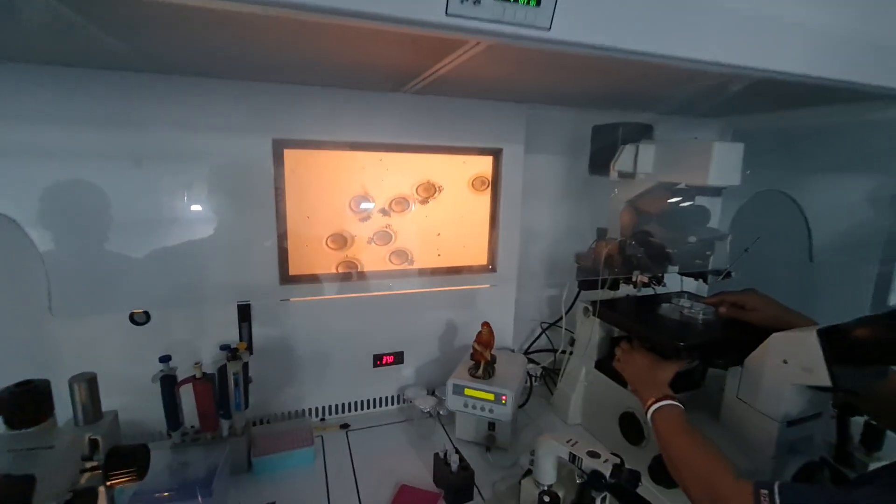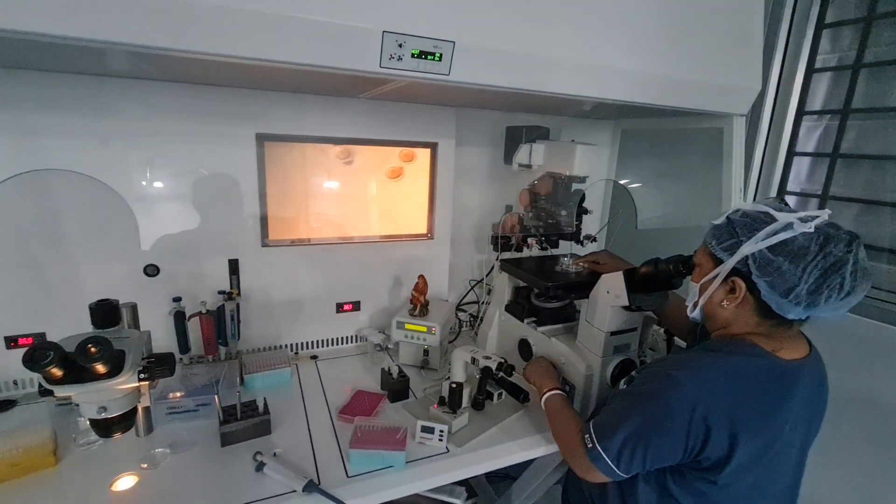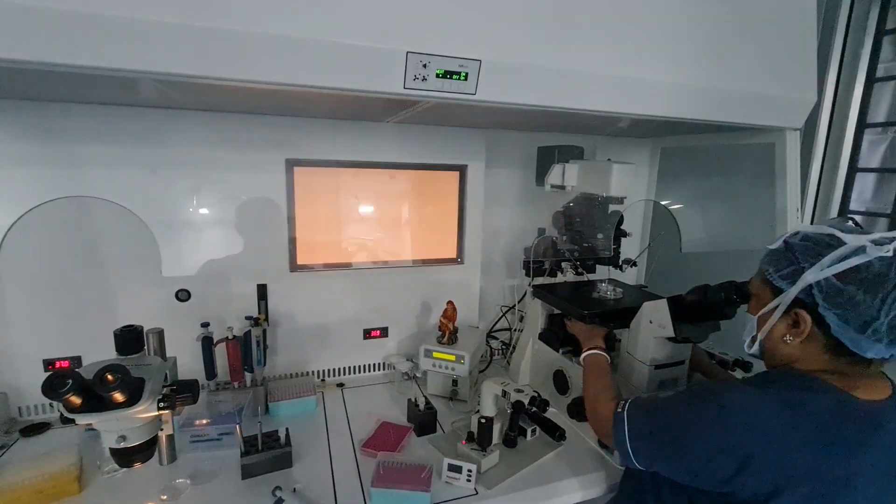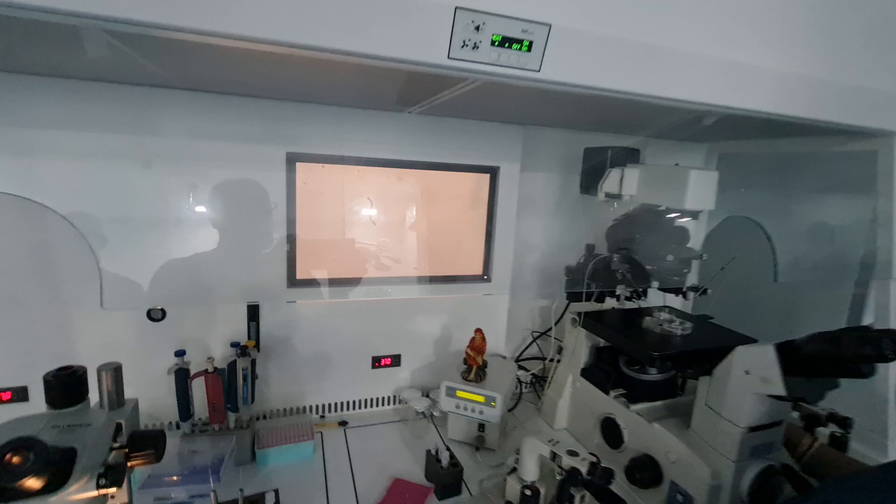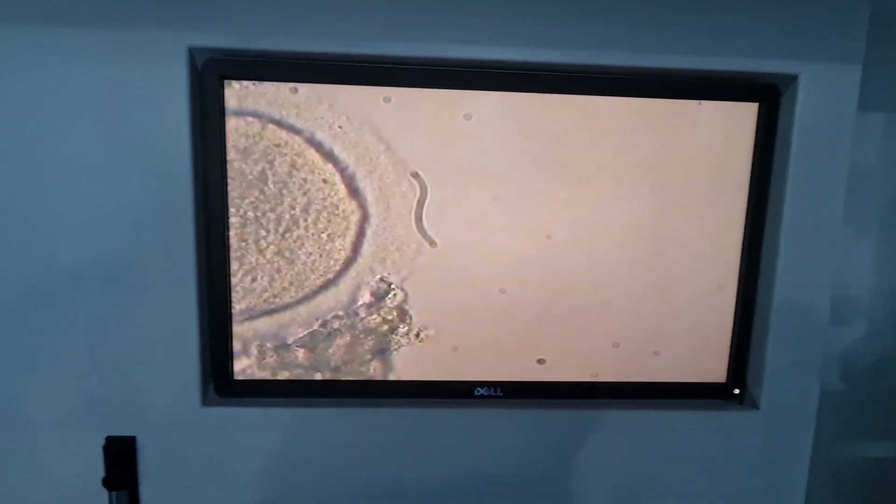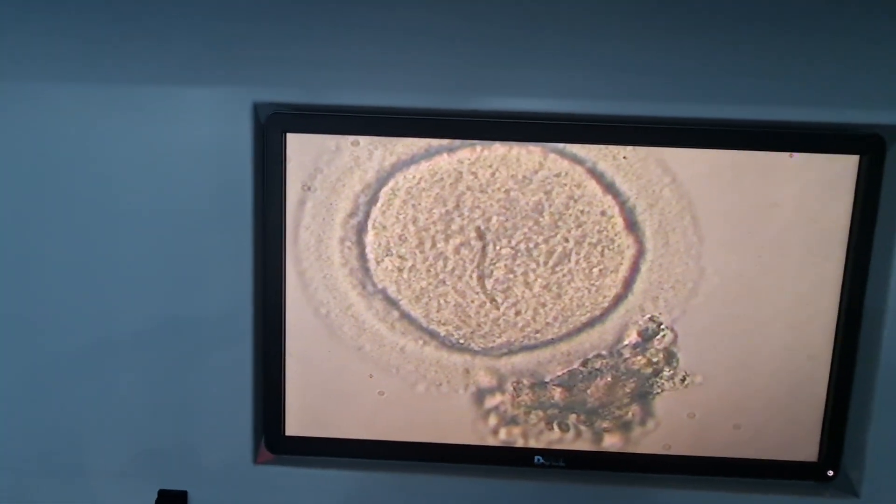Now I will show you the immature oocyte. It looks similar to the M2 oocyte but without a polar body.